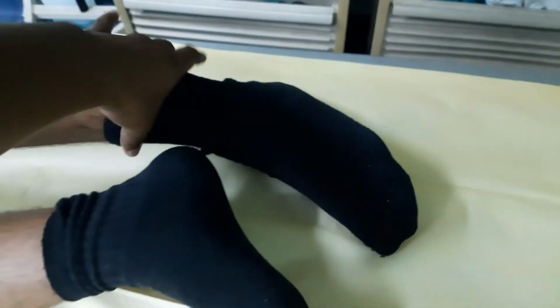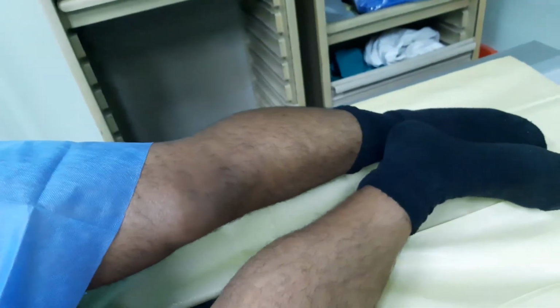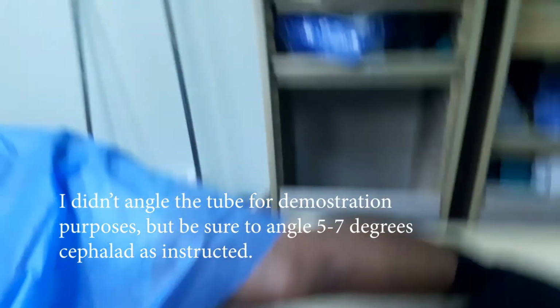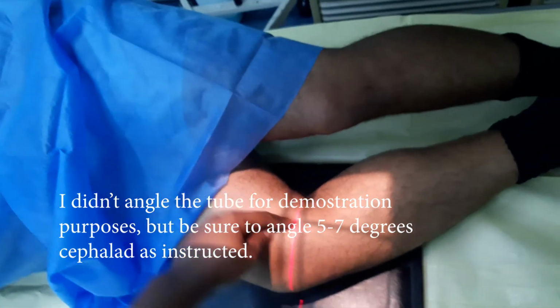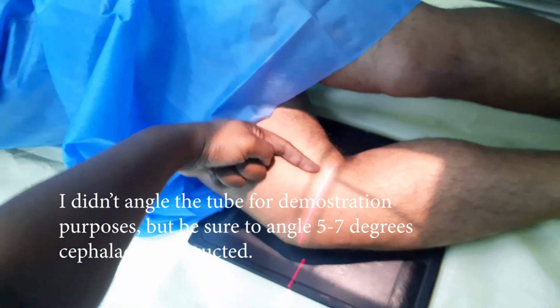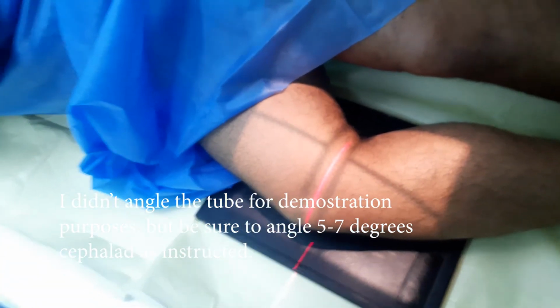Even though he's wearing socks, you'll also know that he's in a good position too, because usually the heel will be lifted off of the table, right, in a slight angle. Some patients may not be able to keep that position, so you could have them bring this foot closer and just rest the heel on top slightly, and that way you could ensure that they maintain that position there. So the knee is now in its lateral position just now, right?